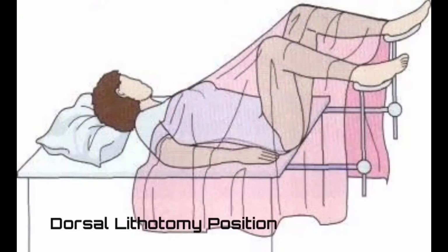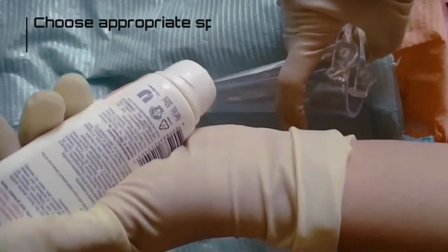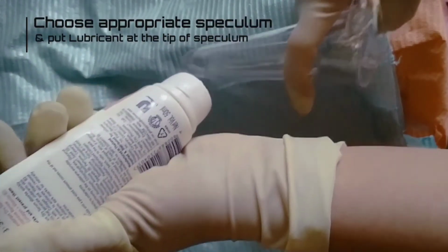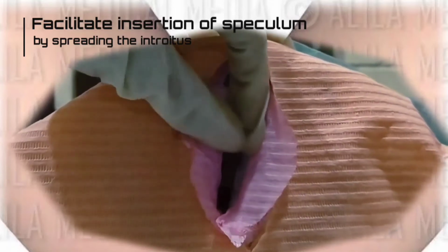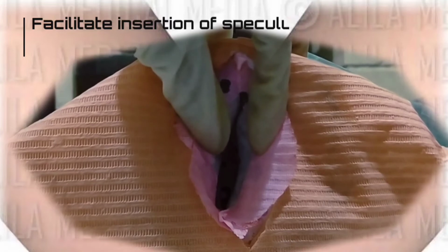Place patient in a dorsal lithotomy position. Observe aseptic technique by putting on gloves. Choose the appropriate speculum for the patient and put on some lubricant. Facilitate the insertion of the speculum by spreading the labium with your thumb and index finger.